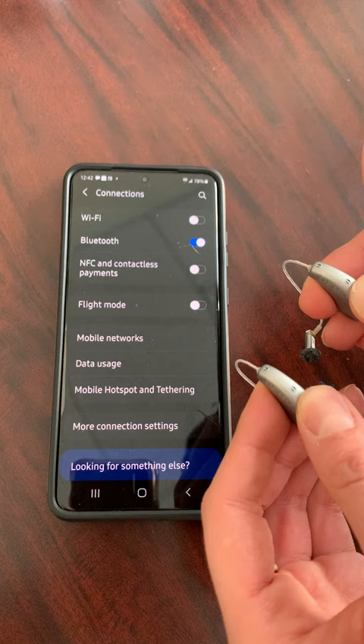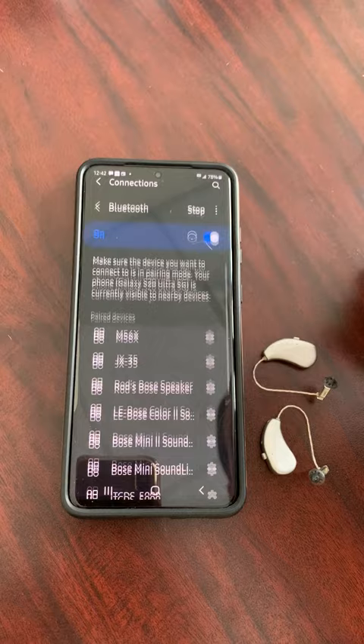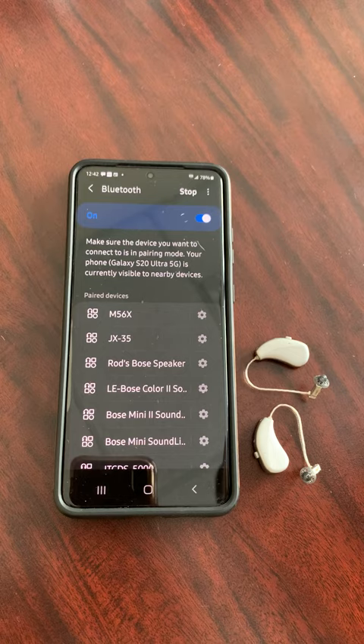So that's what I'm going to do now — off, on — and then I hit Bluetooth, and then it's going to search for nearby devices.